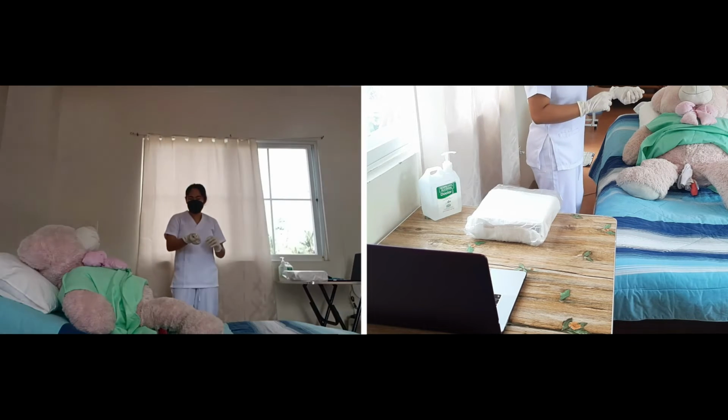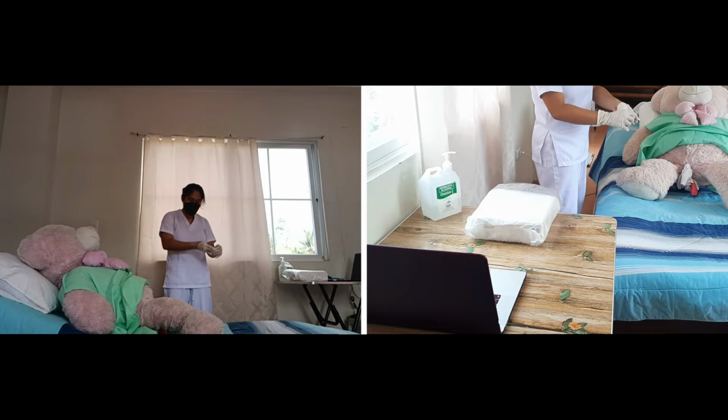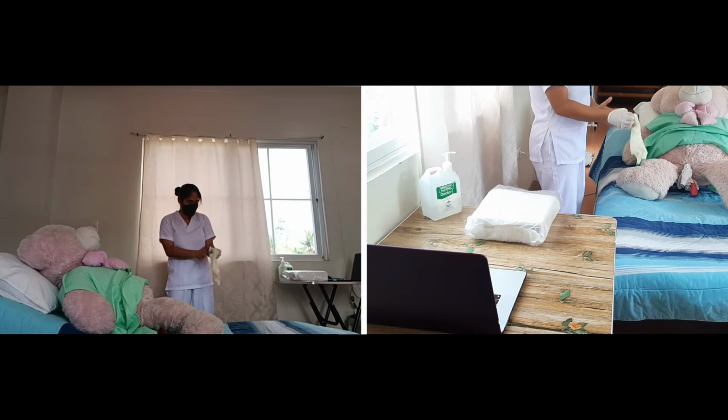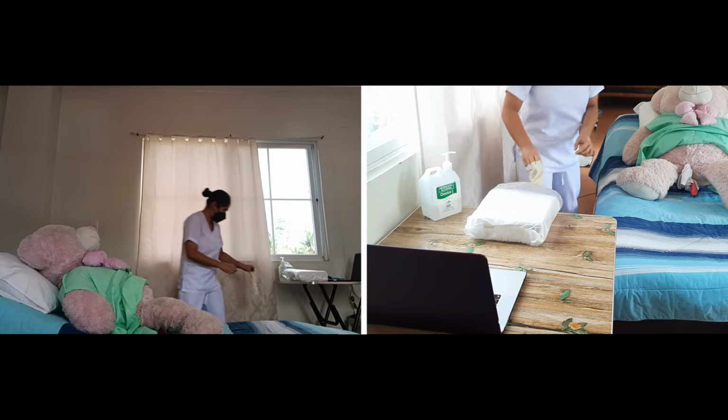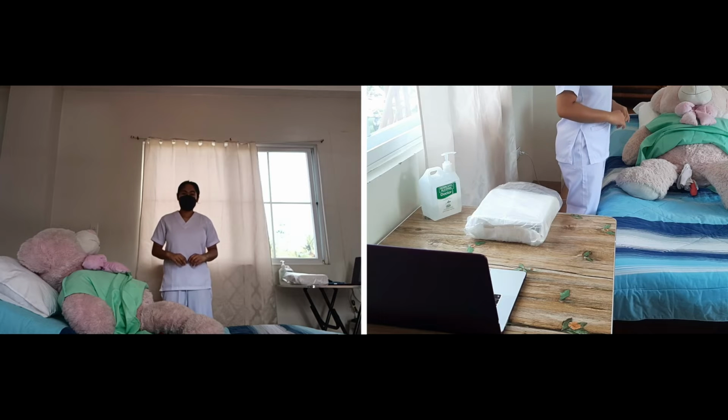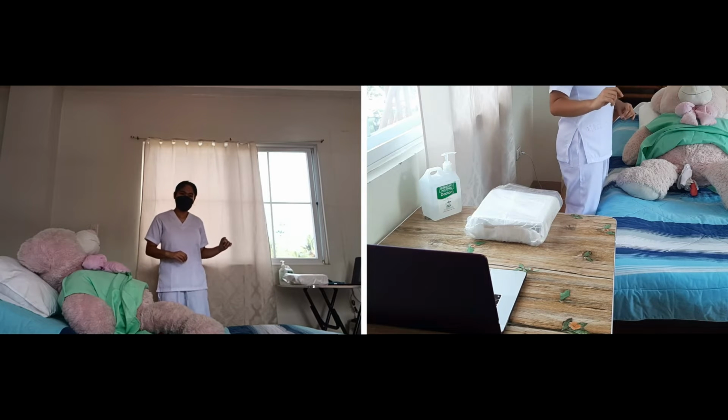Okay, now I'm gonna remove my gloves. Okay. It's about right. So now it is time to drape the patient. So I'm gonna be opening the kit on a clean bedside table.